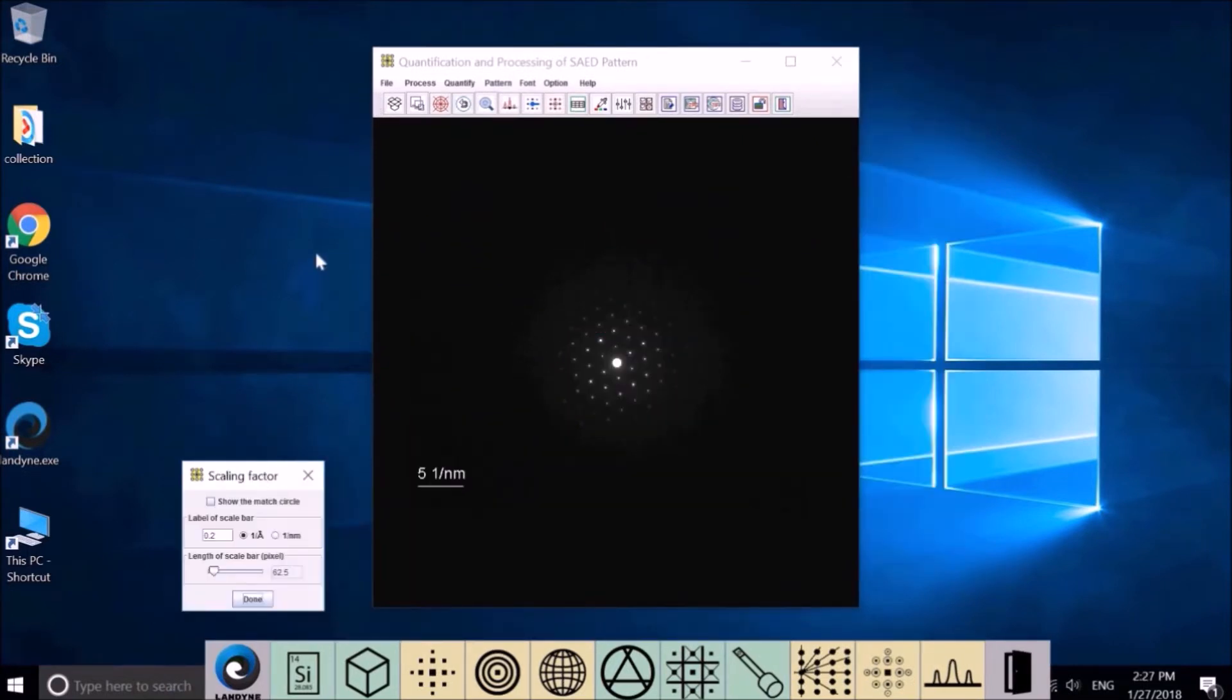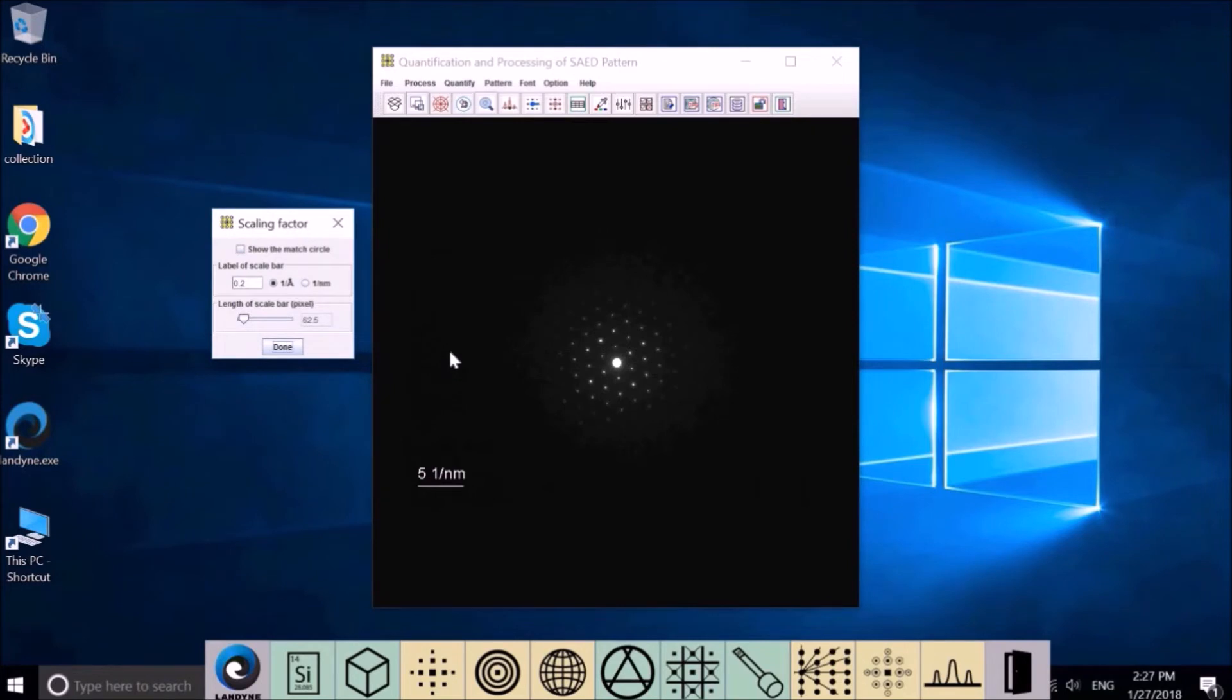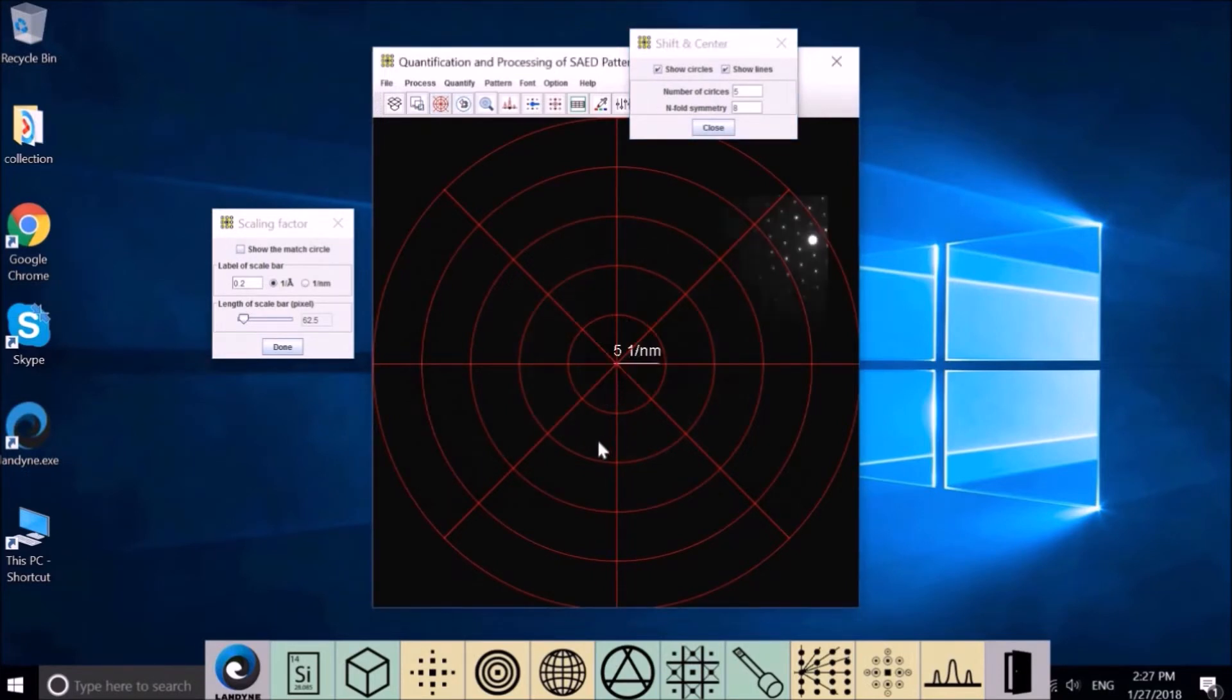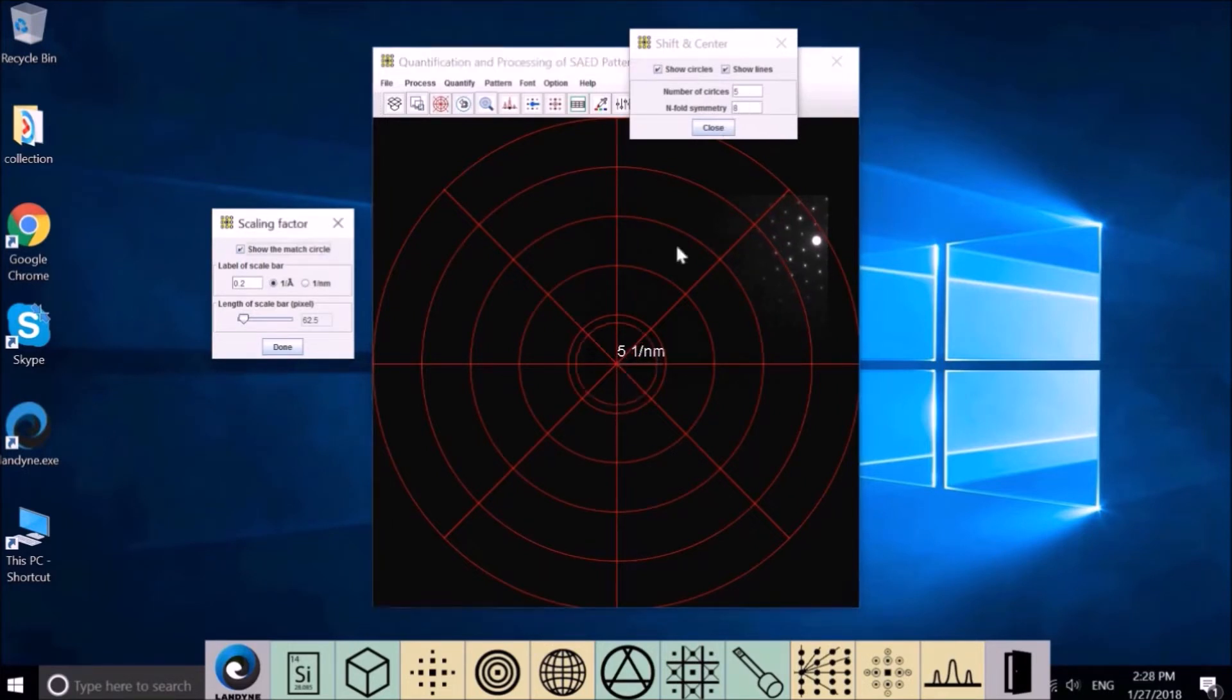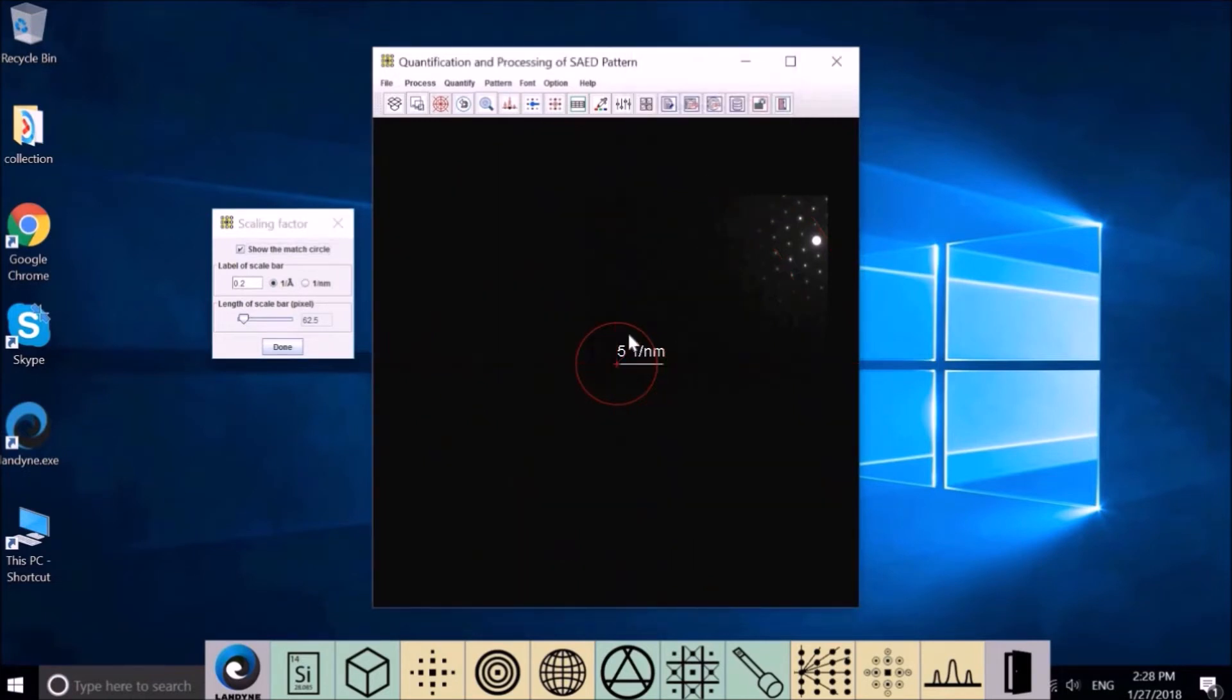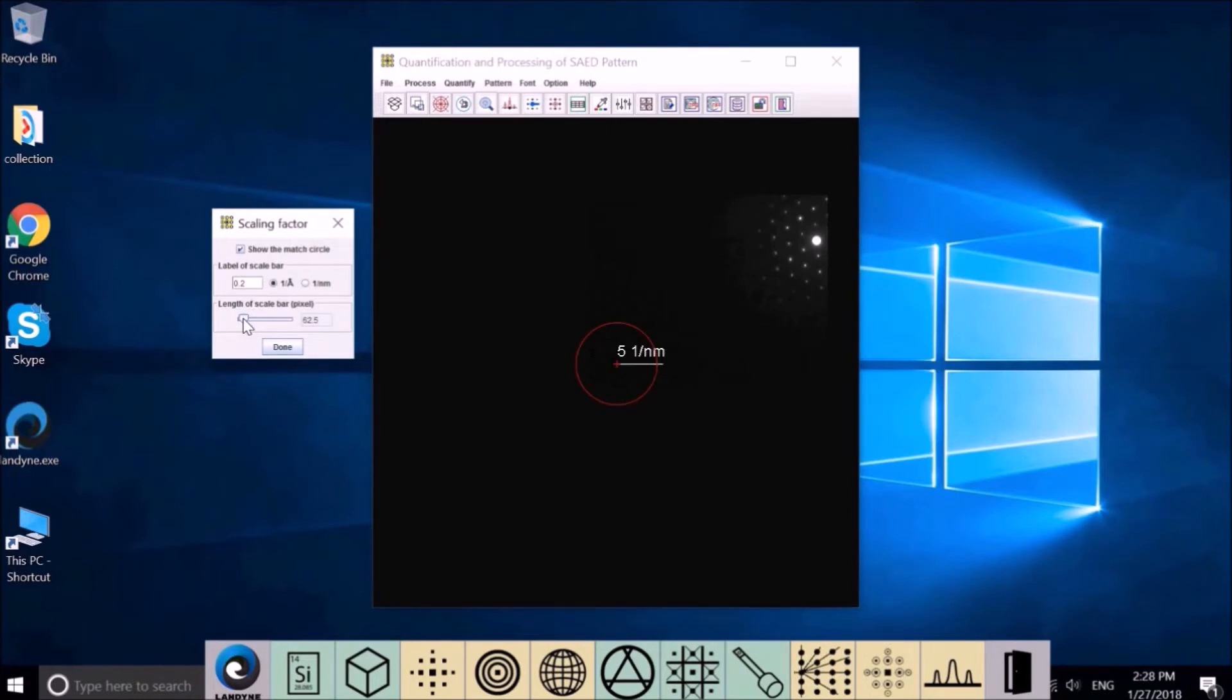We need to calibrate the scaling factor for measured reciprocal lattice. This can be done by shifting the scaling bar to the center. So when the end is in the center, then we can show the matching circle. We get rid of the guide circles.